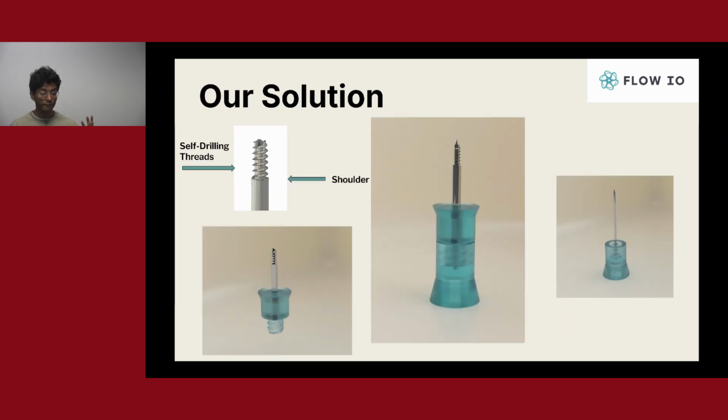For the first problem of extravasation, our solution is designed with a mechanical shoulder that physically stops the needle and only allows a finite length of the needle to enter into the medullary canal. To identify a safe length for the needle to enter into the intraosseous space, we used our results from our study and found the range of safe lengths for all pediatric patients using an inequality analyzing the needle lengths. Essentially, we made sure that our needle would penetrate into the IO space of the largest patients, while not going too deep even in the smallest patients.